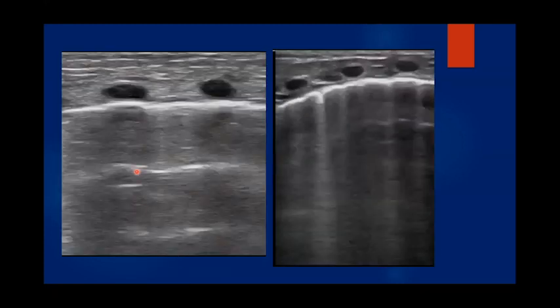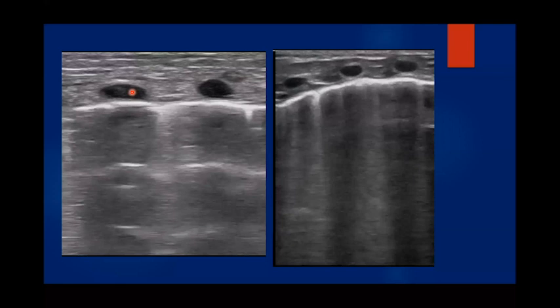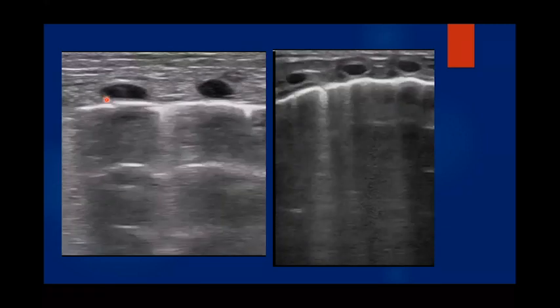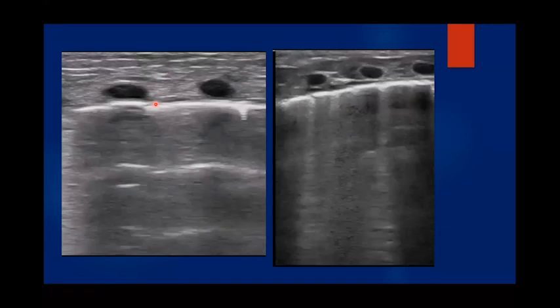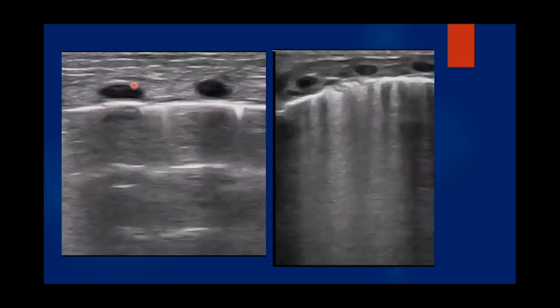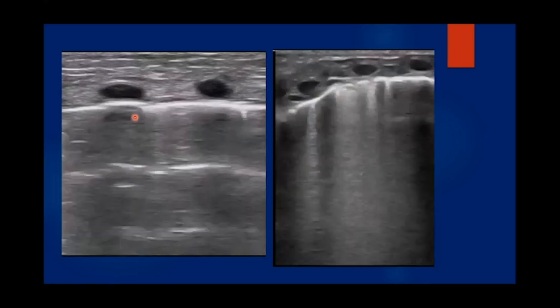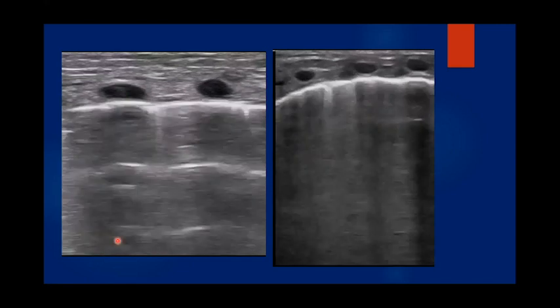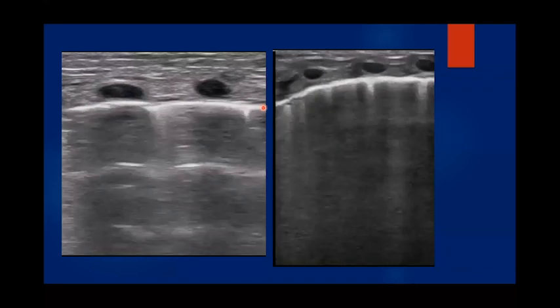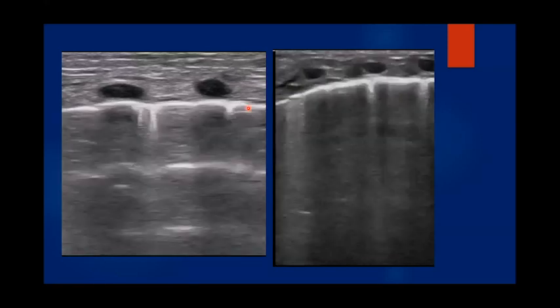Now, let's look at this, and we'll go through the structures so everybody is familiar with it. Here we have two dark structures, and those are the ribs. Typically, if we look at the literature, they will say we'll have the bat sign, and we don't see it very clearly here. The bat sign happens because there is a shadow underneath the rib, and to have a shadow, you need the rib to be ossified so sound does not go through. Now, this is a preterm baby, and the ribs are not ossified, so we do not see the bat sign. So these are the ribs here. Underneath them directly is the pleural line, where you can see that the pleural line is just moving, and this movement is called sliding of the pleura.